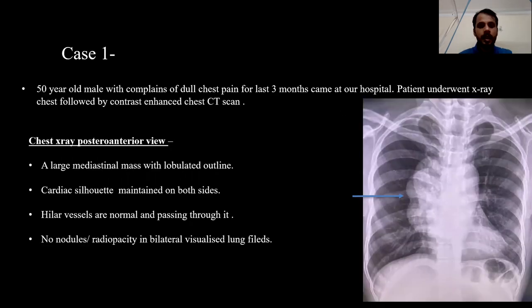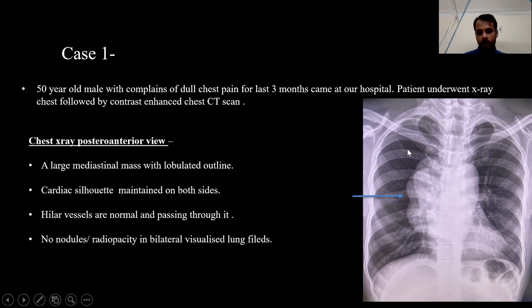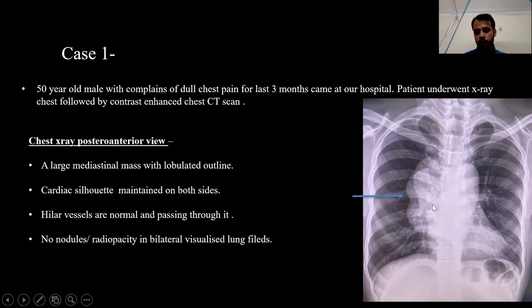Starting the cases. This is the first case of a 50-year-old male with a complaint of chest pain for the last three months. The patient underwent X-ray. On the chest X-ray PA view, we can see there is a large mass with a well-defined outline, surrounded by lung on one side. We can see the hilar vessels are clearly seen passing through the mass, along with the cardiac borders which are clear and not obscured by the mass. This gives an impression of a posterior mediastinal mass.